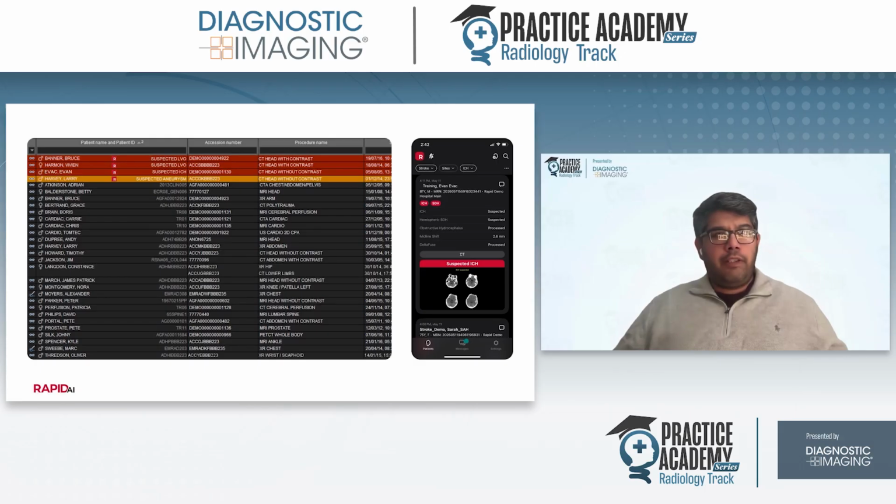So this is what worklist prioritization looks like. And you see right off the bat, it's highlighting 4 cases that it suspects something is going on. So there's suspected LVO, suspected ICH, and suspected aneurysm. And this sort of prioritization tool is extremely helpful, especially with the volumes that we see nowadays.